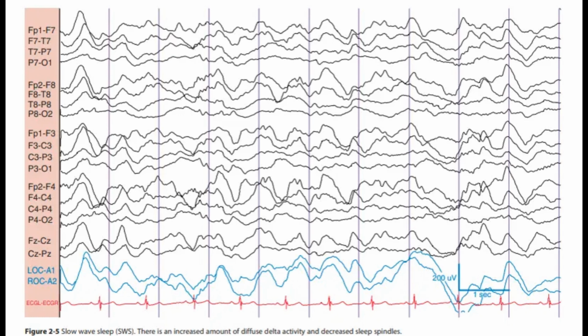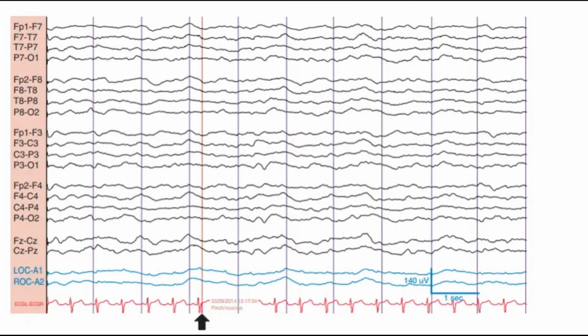It's like in deep sleep mode. But here's the thing: if you see delta waves when someone is awake, that could be a red flag. It might suggest there's an issue in that specific area of the brain. They're supposed to be sleeping, so if they're awake and they're having these delta waves, that's when we start to worry. That's a sign that something's not quite right, something to investigate further.